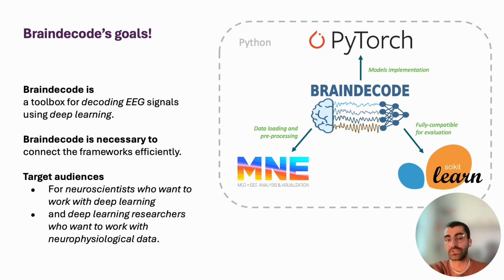There's a very clear trend at the moment showing that deep learning models are very promising or are already obtaining some good results, even state of the art sometimes. But deep learning is also known to be data hungry. So you need efficient pipelines to provide enough examples per second to these deep learning models such that they can be trained. Because you need to be able to handle very large amounts of data and very quickly.